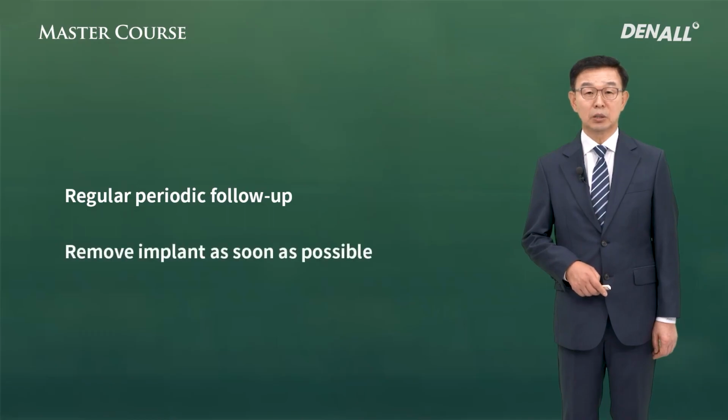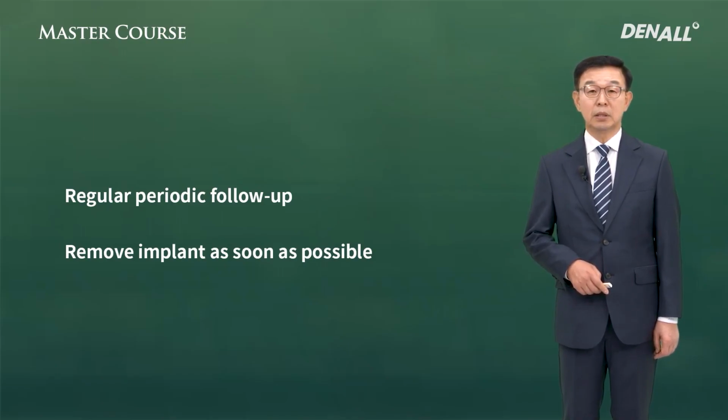If the implant has migrated into the sinus, you need to remove it as soon as possible. To be able to do this, you need to know the right techniques to remove the implant ahead. I believe that would help you a lot.